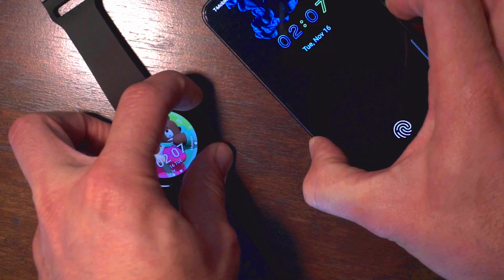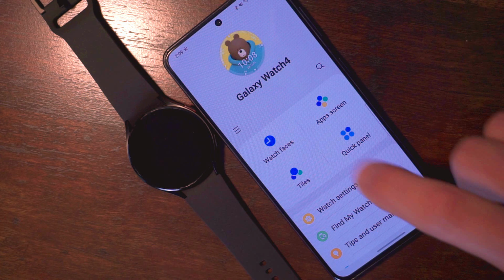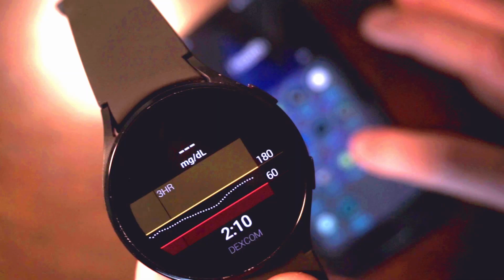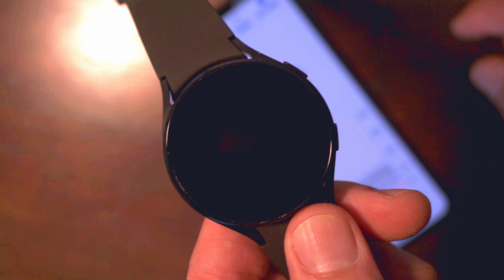Now lastly, power down your phone and your watch and let them sit for 5 minutes. Then power them back up, allow them to boot, and then go into your Galaxy Wearable app from your phone. Click on Watch Faces, select the Dexcom face, and then, boom, it's alive. It's alive!